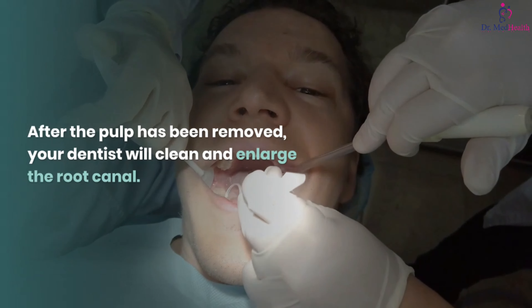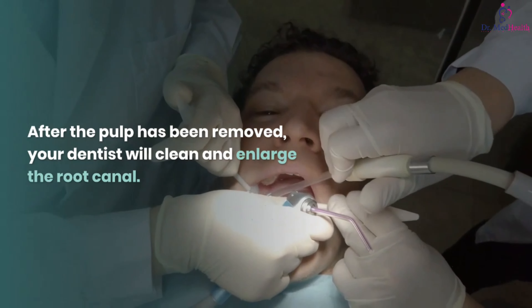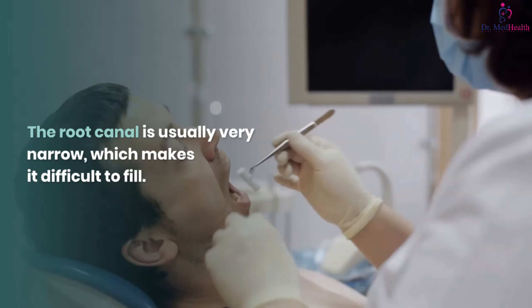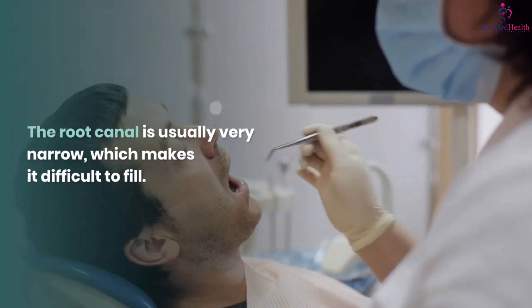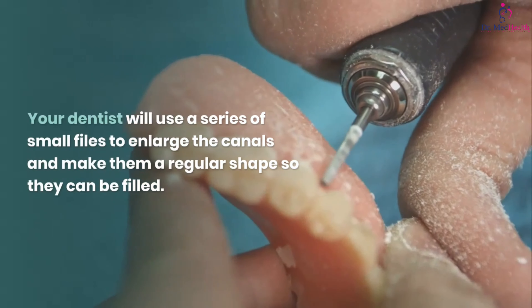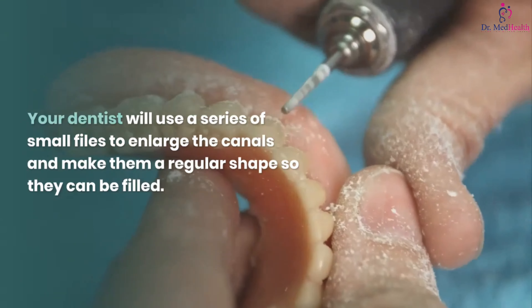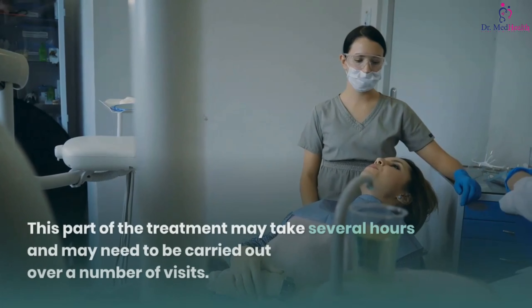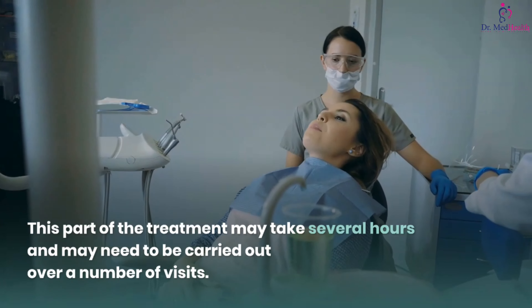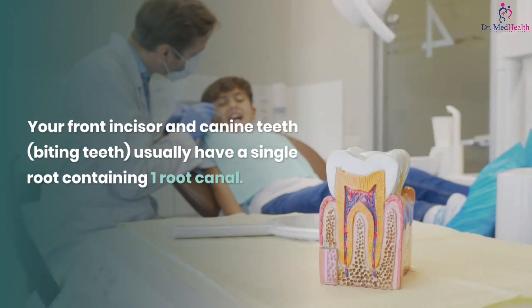Cleaning and filling the root canal. After the pulp has been removed, your dentist will clean and enlarge the root canal. The root canal is usually very narrow, which makes it difficult to fill. Your dentist will use a series of small files to enlarge the canals and make them a regular shape so they can be filled. This part of the treatment may take several hours and may need to be carried out over a number of visits.